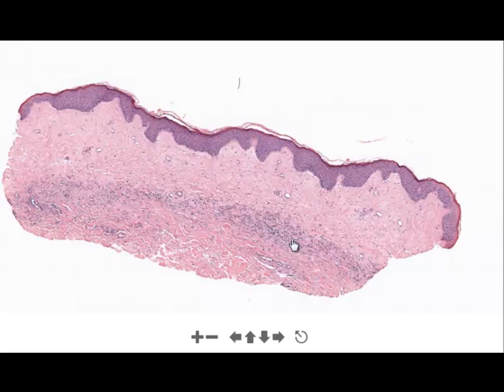Moreover, you can start to see that an inflammatory infiltrate is building up that almost appears lichenoid, but instead of being lichenoid along the dermal epidermal junction, this inflammatory infiltrate is lichenoid abutting against the areas of homogenization of the papillary dermal collagen. So now let's take a look at the specimen on higher power.